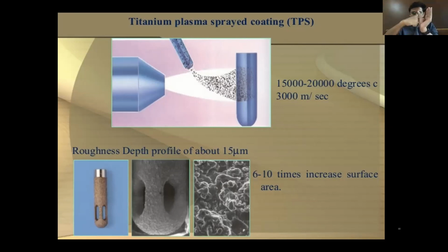But the problem of these additive processes was that the osteotomy site had to be smaller than the diameter of the implant. So once we put the implant inside that osteotomy, these globules attached on the outside used to get removed from the implant surface. Ultimately, all the coating of the implant used to be lost. So nowadays, hardly any implants have additive implant surfaces.